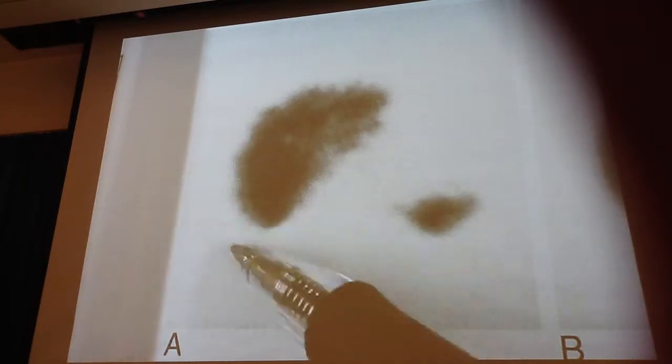And then we apply a high-pass filter to make the edges sharper, and then we smooth it with what we call a low-pass filter. So you notice that the edges look a little bit smoother now, they're not as sharp and jagged. Basically we use this to eliminate noise in the image, and we use the high-pass filter to sharpen the image, and sometimes you'll use a combination of both of these.